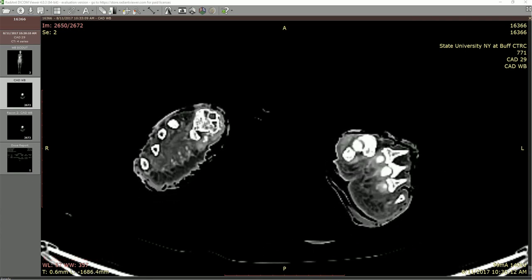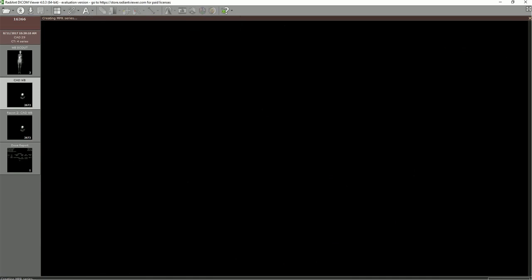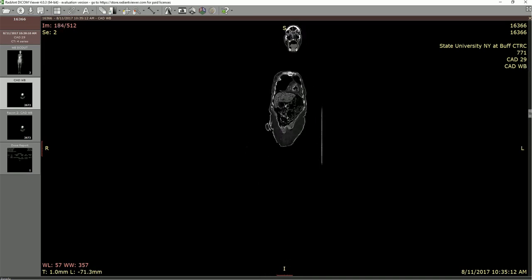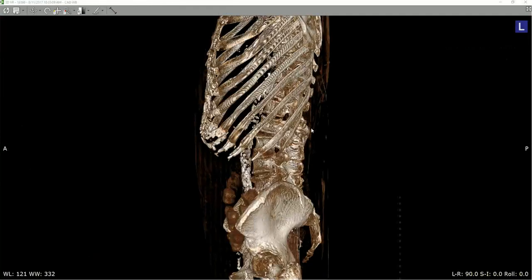Now, using the multi-planar reconstruction button in Radiant, we can also briefly go to a coronal view. I'm not going to take nearly as long on this as I did with the transaxial. This would be towards the front of the body. As we move in, you can start to see the lumbar vertebrae appear. Remember that because of the curvature of the spine, as we go from front to back the lumbar vertebrae are going to be seen first. As we get into the vertebral canal and move further back, it looks like it's kind of migrating upwards because the vertebral column is curved and angular.